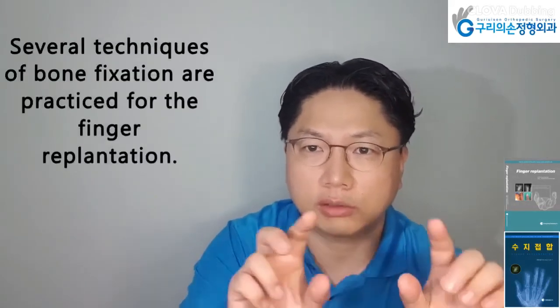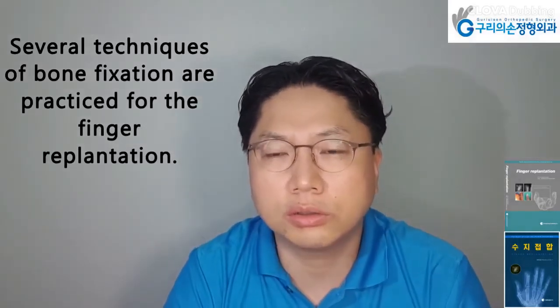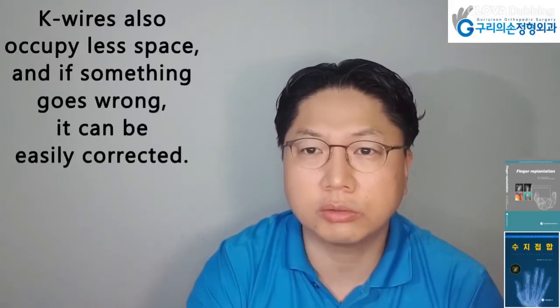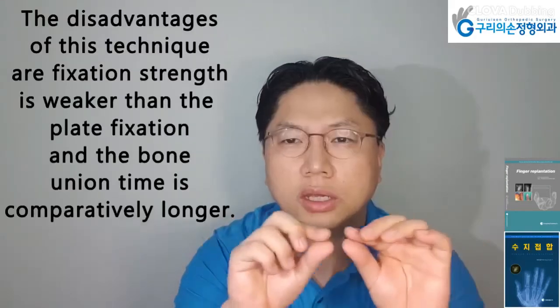The author prefers to fix the bone with K-wires as it is simple and requires less time to fix. Several techniques of bone fixation are practiced for finger replantation. Plate fixation can cause deep wound infection due to open wound. K-wire fixation is the simple method to fix, and K-wires also occupy less space. If something goes wrong, it can be easily corrected.